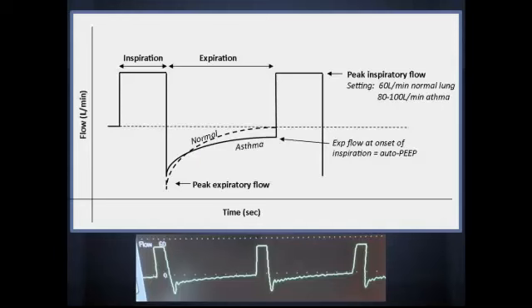So you can see evidence of this on the vent in two different ways. One is on the flow diagram that we looked at earlier. In asthmatics, there's a delay in the return of the expiratory phase back to the baseline of 0. So the normal patient is here in the dotted line. You can see that they come up a lot quicker back to 0. Their exhalation happens quickly, and they approach the 0 line before the next breath.